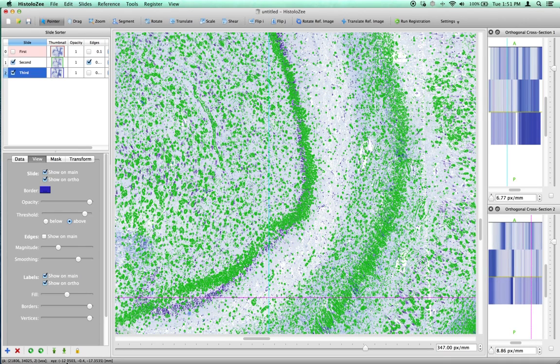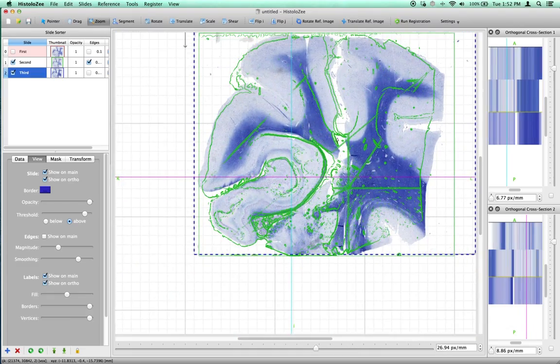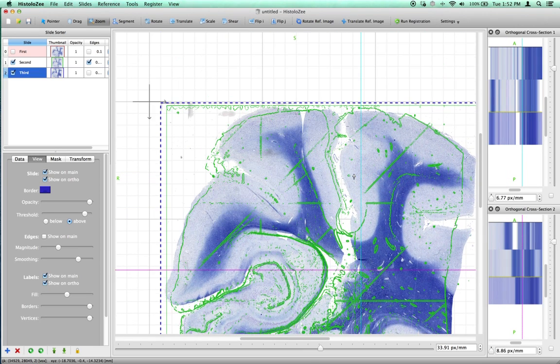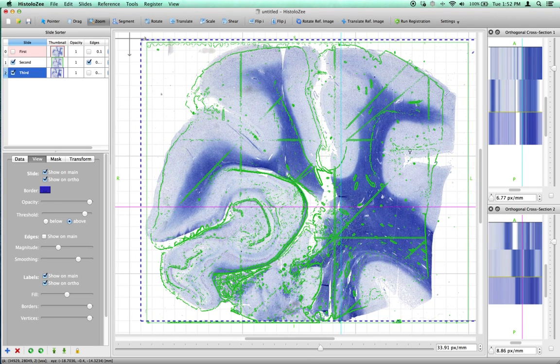And you can inspect the world coordinates at the bottom, in the status bar over here. So again, just to reiterate, since we are in a world coordinate system, we don't have to be so concerned about which slices we keep fixed and which ones we move, because everything can be exported keeping this world coordinate system intact.